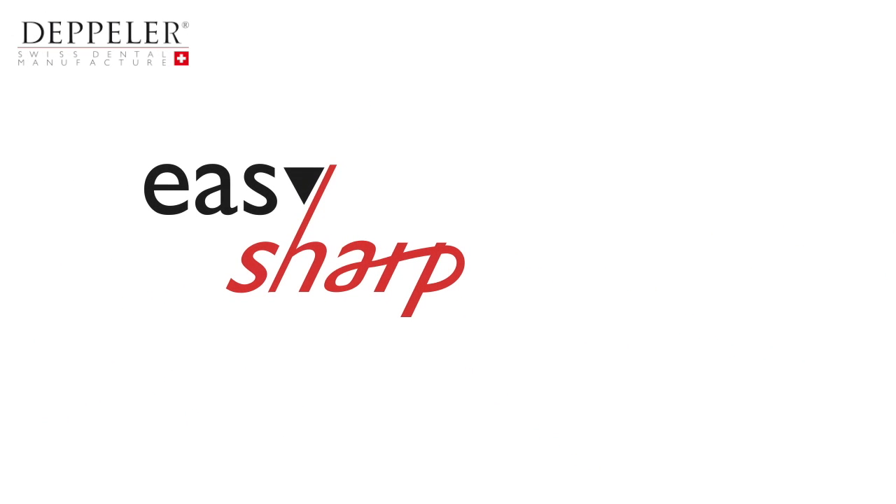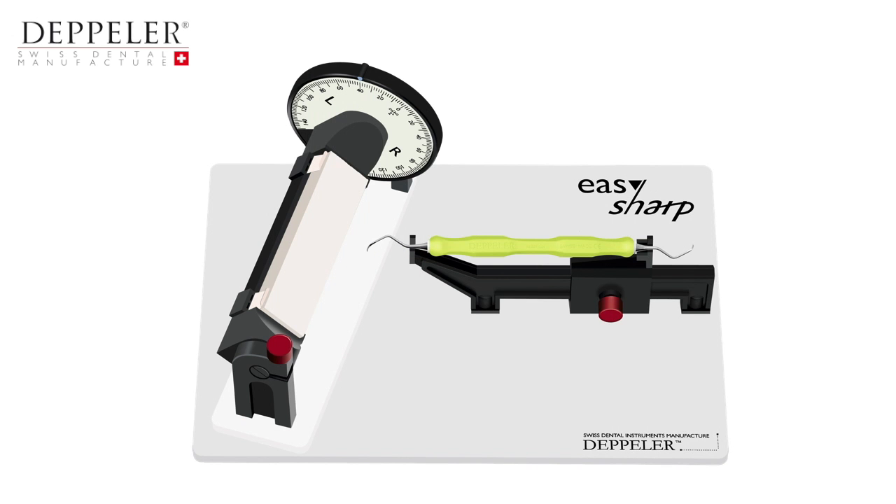The aim of this video is to teach you how to use the EasySharp appliance. It will also allow you to understand our method and to keep your instruments in perfect working order throughout their life cycle.